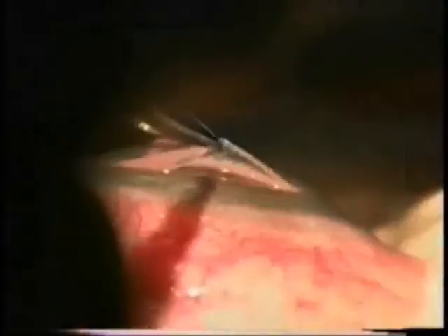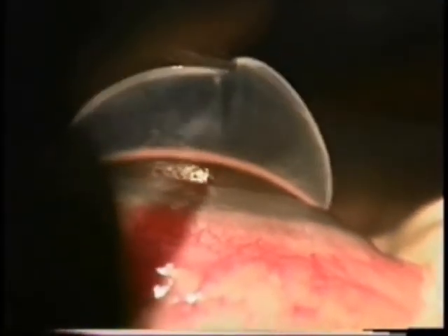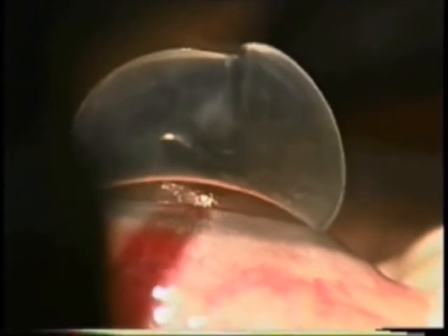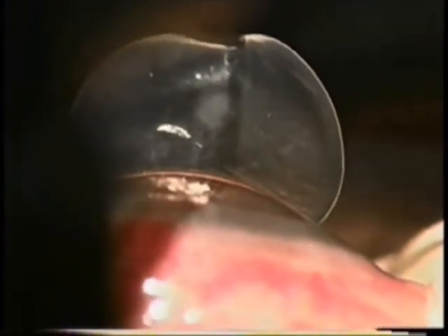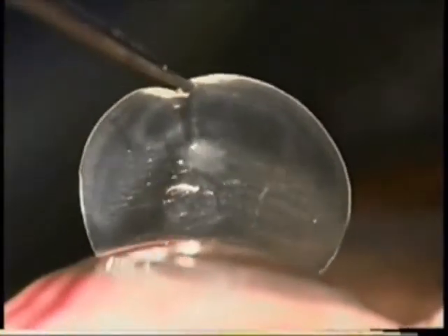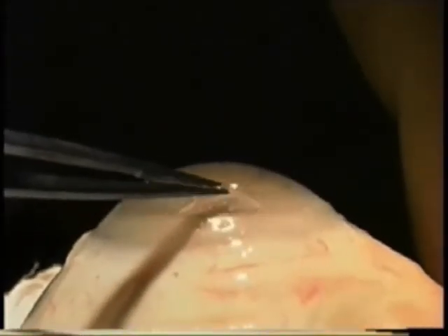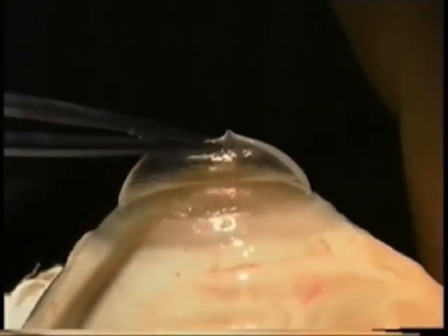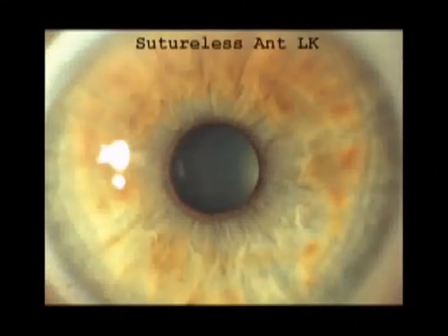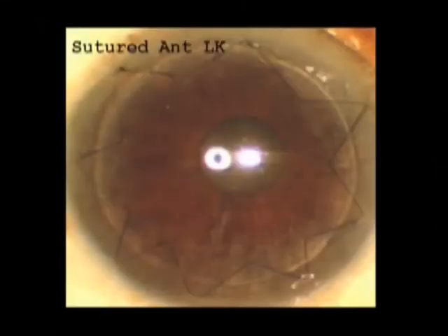In cases of deeper opacities, a lamellar layer needs to be created using automated techniques, as seen here, with the scar contained in this lamellar. A similar lamellar layer needs to be created on the donor eye, and this flap can then be replaced using sutureless techniques or sutured anterior lamellar keratoplasty.